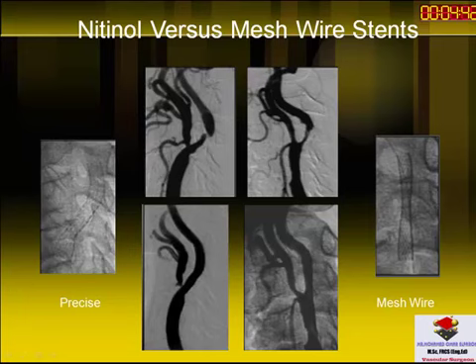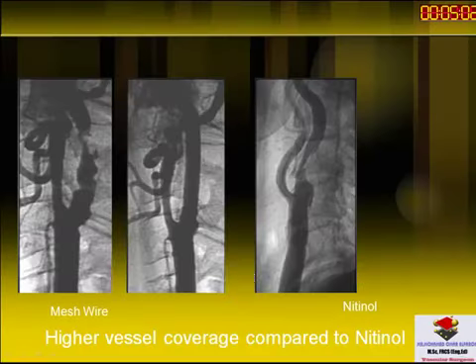In a Nitinol stent, it will have a smooth curve, and you will get a curved stent. In the case of the second picture on the right side, you will have a straightening of the vessel, and the kink will shift more distally. And if you get a plain X-ray, you see the stent in an upright position, it doesn't curve.